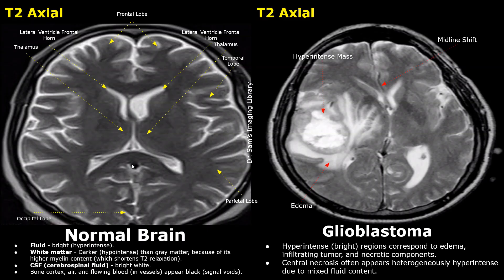On the right, we have a T2 image showing a mass in the parietotemporal lobe which was a glioblastoma. A glioblastoma appears bright in a T2 image. These hyper-intense areas correspond to edema, infiltrating tumor, and necrotic components.